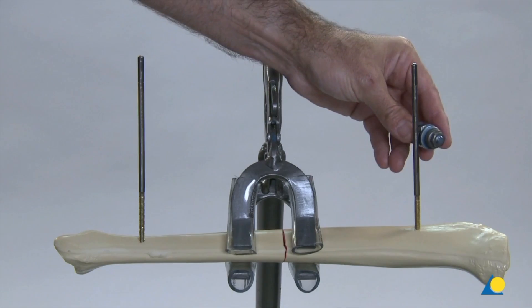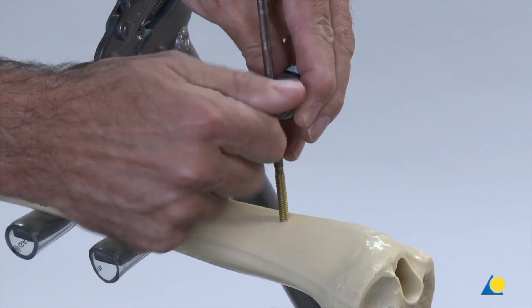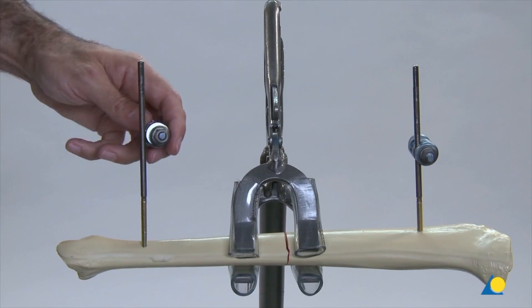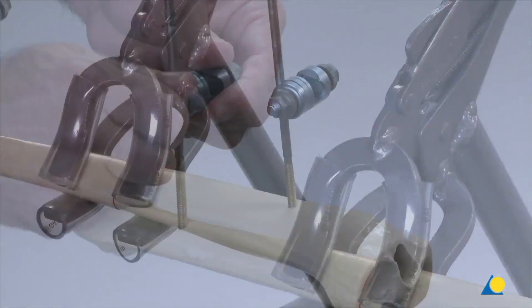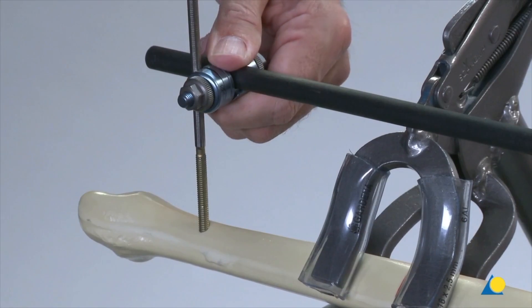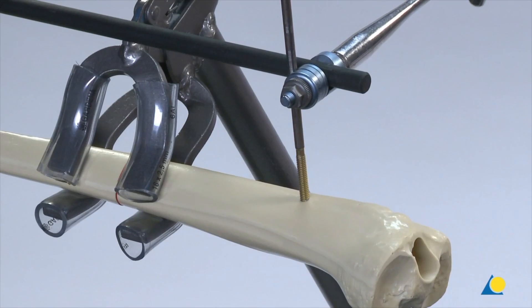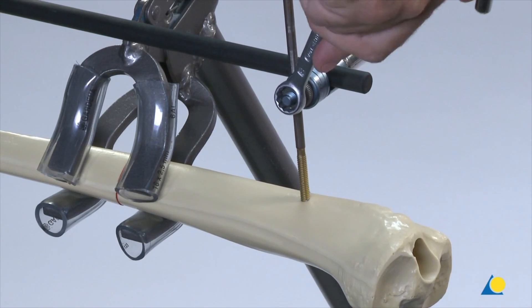The large open self-holding clamps connect a carbon fibre rod to the Schanz screws. The clamps are first tightened to the Schanz screws by hand. The carbon fibre rod is clicked into the clamps. The socket wrench is used to tighten the clamp, and correct limb alignment is verified using the image intensifier before final tightening. Tightening is completed with the combination wrench.